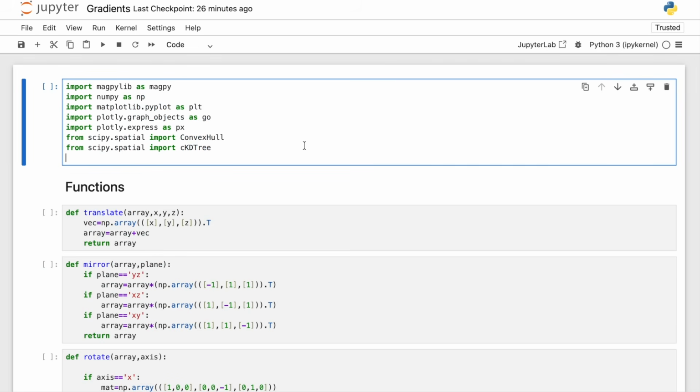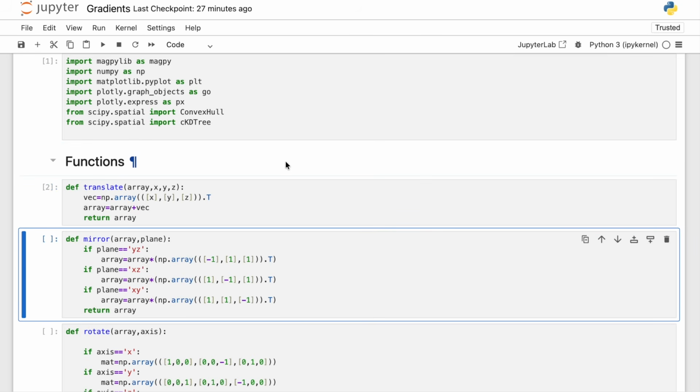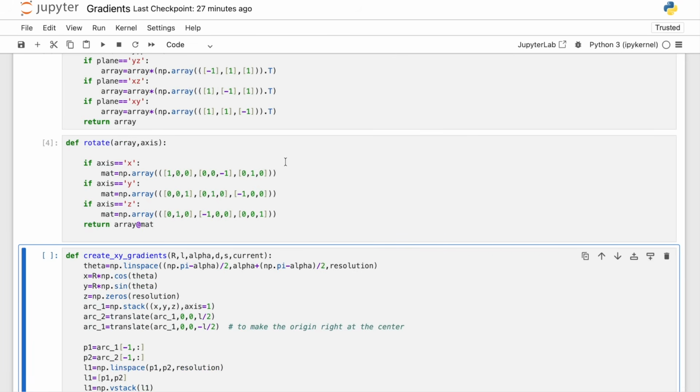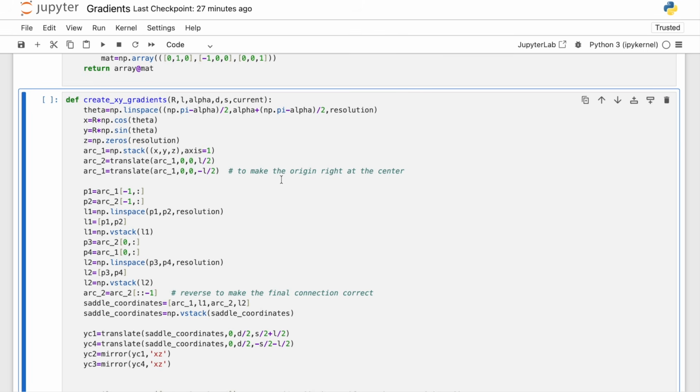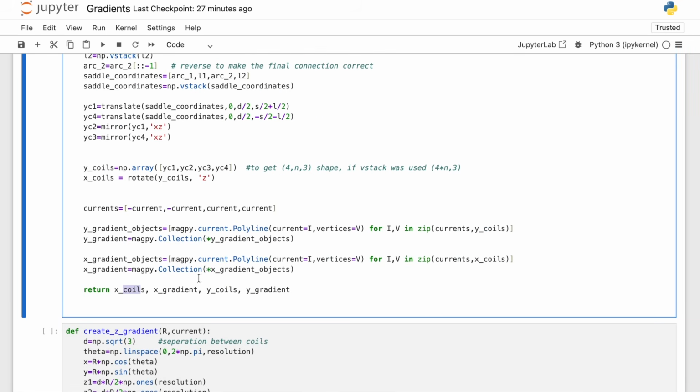So now we are in Jupyter Notebook, and let's start by importing the main libraries we'll need. Here are the functions which I spoke about. Here we have the translate function, the mirror function, the rotate function, and here I grouped everything to create the XY gradient into a single function, which just takes radius, length, alpha, distance, separation, and the current as inputs, and returns the X coil coordinates, the X gradient as a Magpy object, so this is a magnet, the Y coil coordinates, so by coordinates I mean they are in the shape n by 3, and the Y gradient, which is again a magnet.